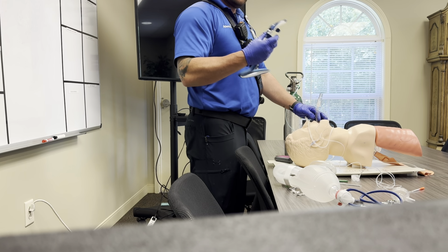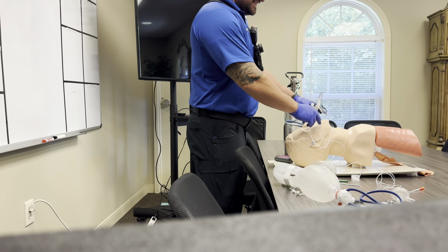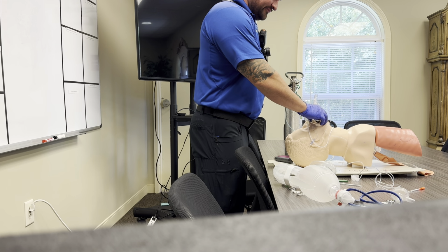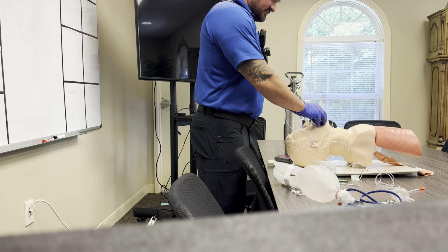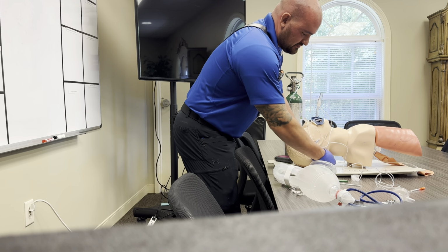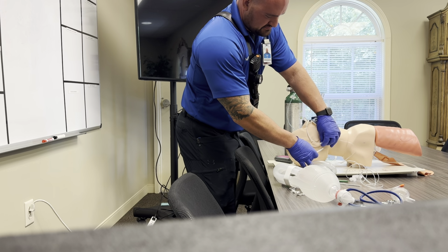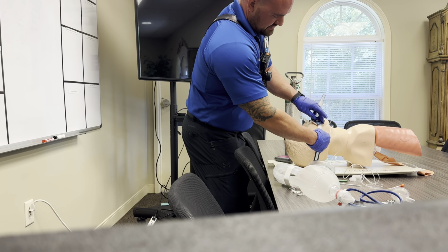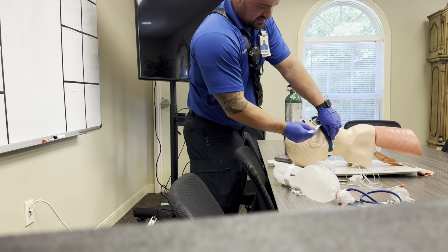Lastly, again, I know I've let go of the tube and I said not to. Makes it easier with a partner. But lastly, we're going to secure this tube. So the tube is secured. Come around. At this point, you can either leave the nasal cannula on or you can turn it off.